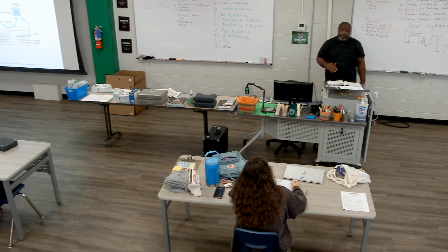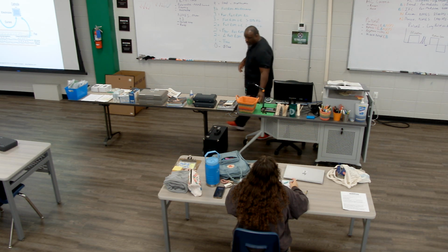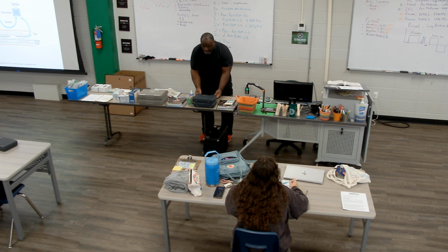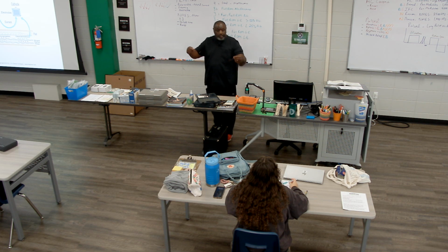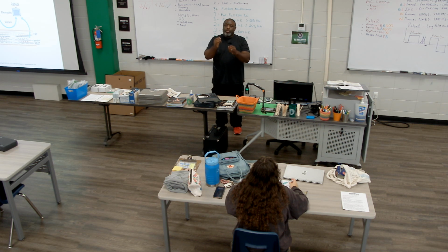So up until now, we haven't done anything with charge, so it hasn't been relevant. On the lead wires, when you're looking at them, you'll have a black and a red. Black is going to be your cathode, red is going to be your anode. So it's just like a battery in a car.